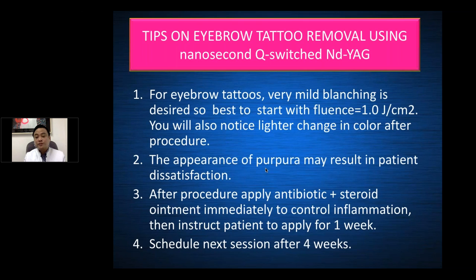You will also notice a lighter change in color after the procedure. The appearance of purpura, so you have to be very careful, because if there's purpura, this may result in patient dissatisfaction. After the procedure, we should apply an antibiotic and a steroid ointment to control inflammation. Then we instruct the patient to follow up after 4 weeks.